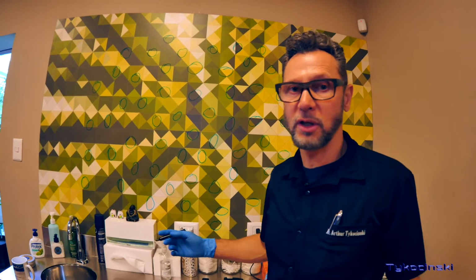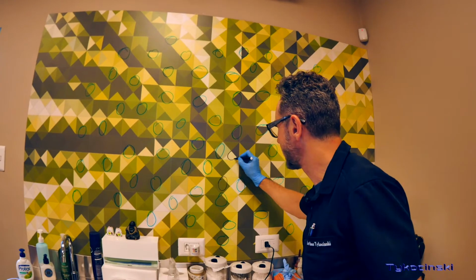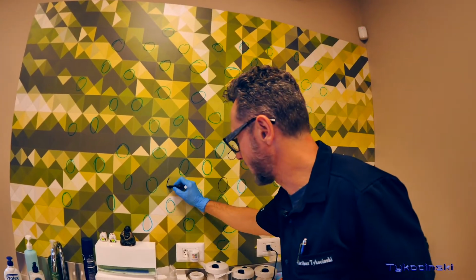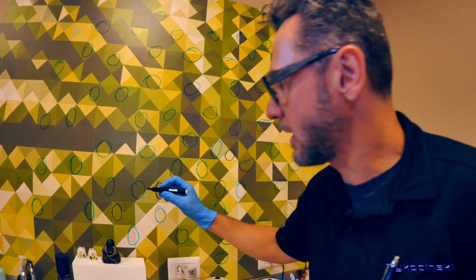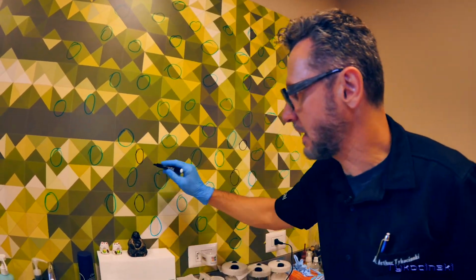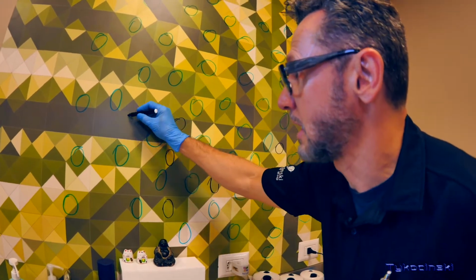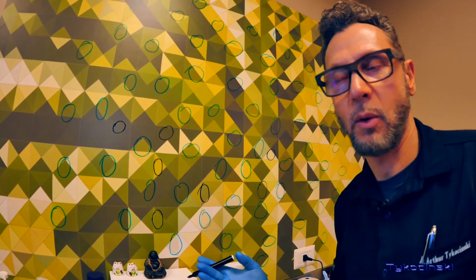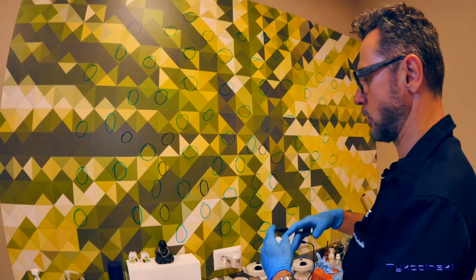Now we are going to do the second procedure. Second procedure, we're gonna complete some empty space that we could find and still manage to not over-harvest. We can carefully select areas and remaining residual follicular units so as not to break them. We don't want to break the overall structure of the donor area.